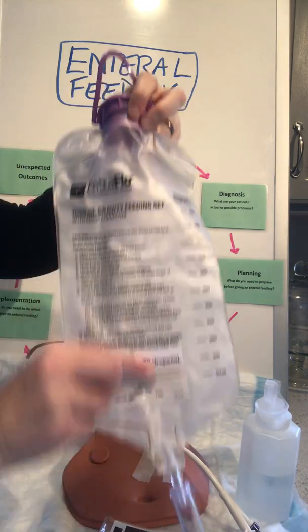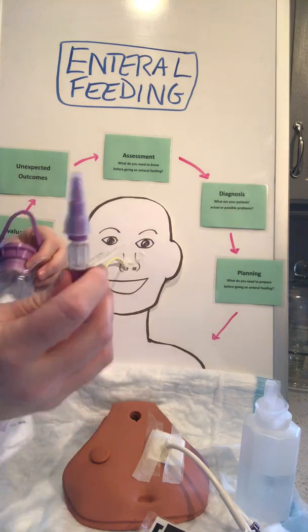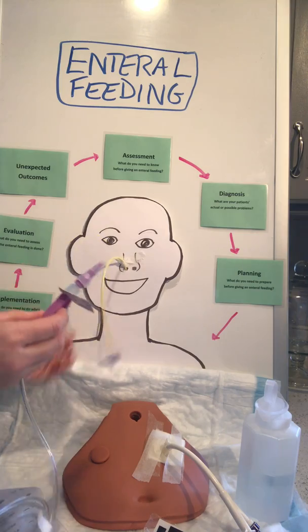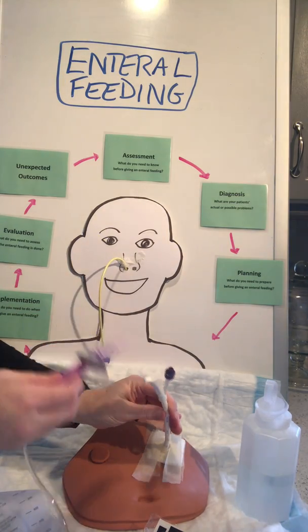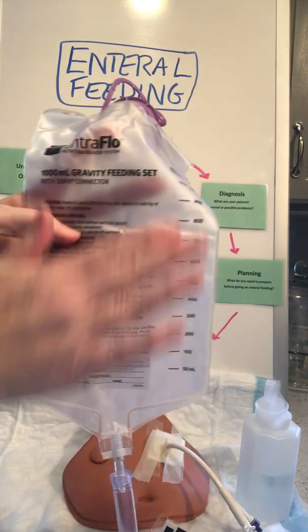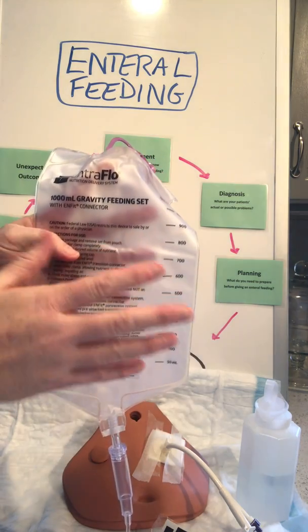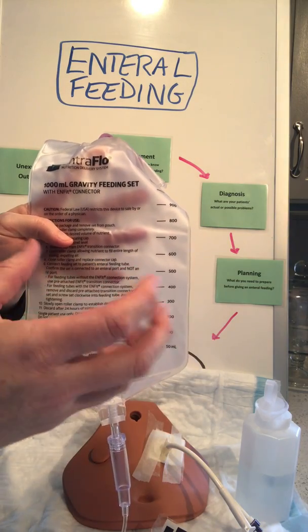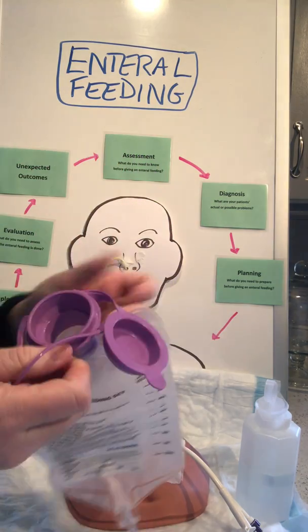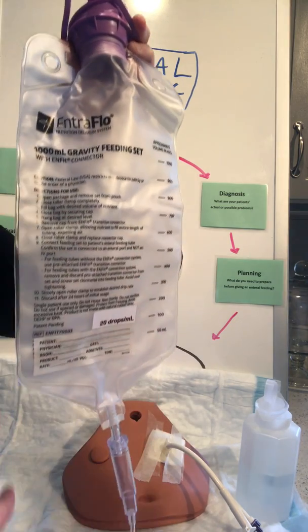So what comes in this is a bag pre-attached to tubing with then an end piece that's going to connect to either our nasogastric tube or to our G-tube, whichever one we're using. Now there's a couple of parts on this bag or on this set. The bag itself has measurements on it. We typically measure out the enteral feeding that we're going to use. It either comes in a can or it comes in a bag or some other container, and we pour it into the top of this bag. We close the lid and it's pre-measured for us, so we know how much is going to be in there.